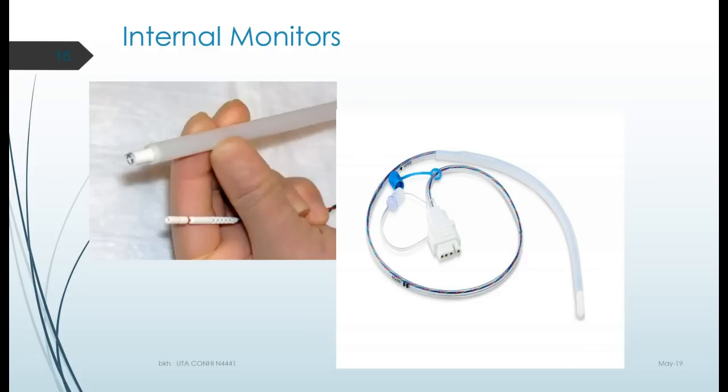Now reach down and feel your chin. There's just a tiny bit of mush, but then you get to that firm chin bone. So if while you're feeling mom's fundus, her uterus, during these contractions, you can barely dent that at all, then we call that a moderate contraction. And then reach up and feel your forehead. When you push on that uterus, it feels like your forehead. It's not dentable. Then that is considered a strong contraction. So with an external monitor, all you can say is that they're mild, moderate, or strong. With our internal monitor in, you can talk about exactly how strong those contractions are.